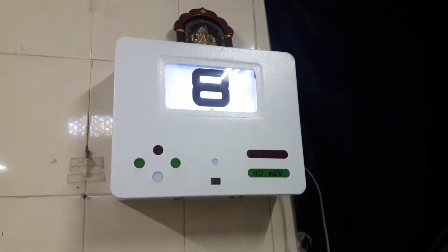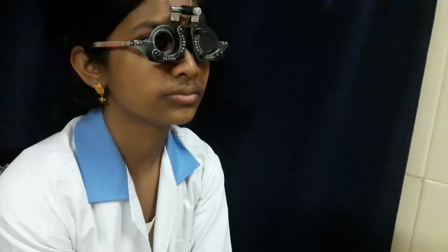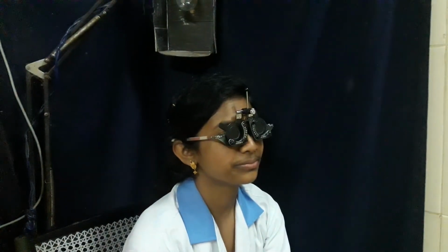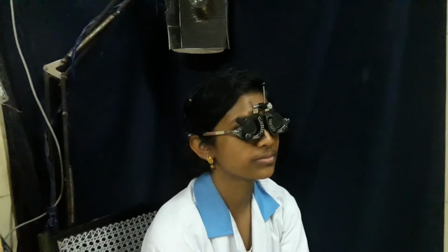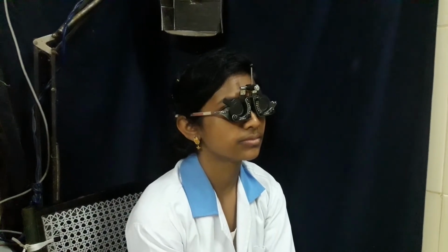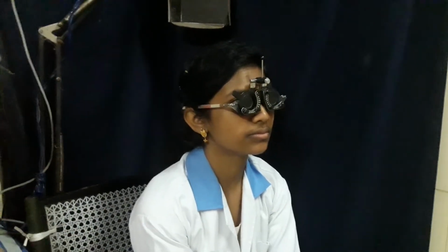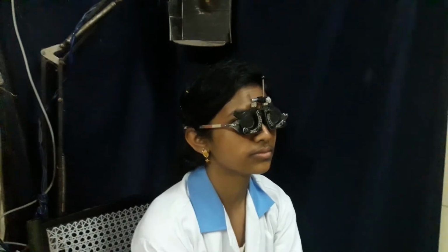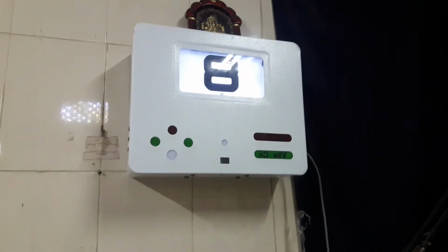After the distant vision is recorded, we go to the patient and apply a pinhole in front of the right eye, and the patient is asked to read again. If the patient is able to read a few lines more than what he read in the previous situation, that improvement is noted down.